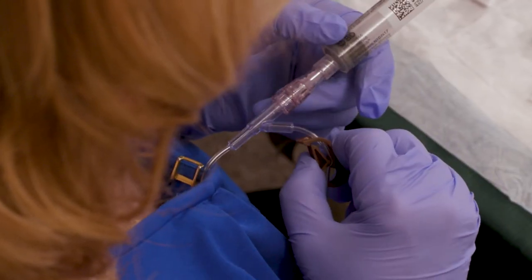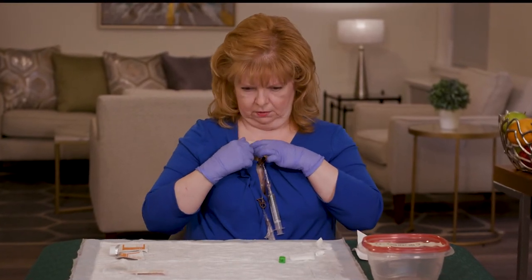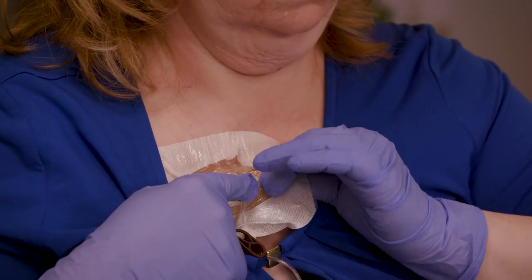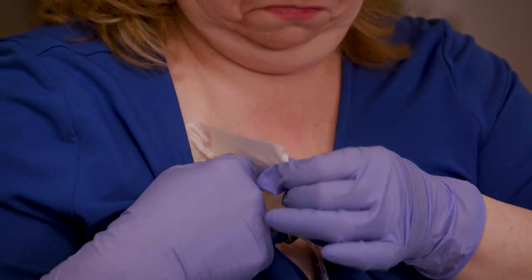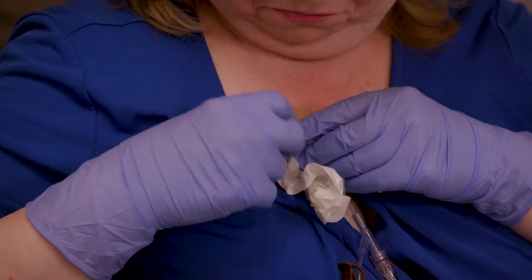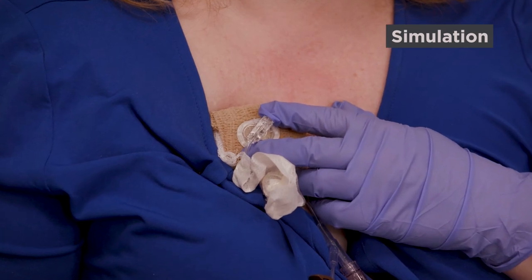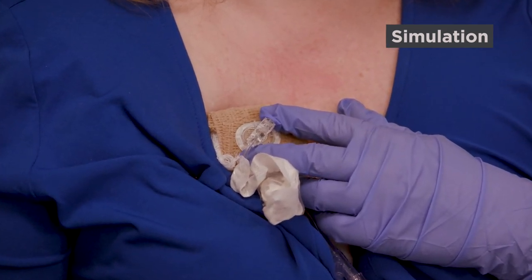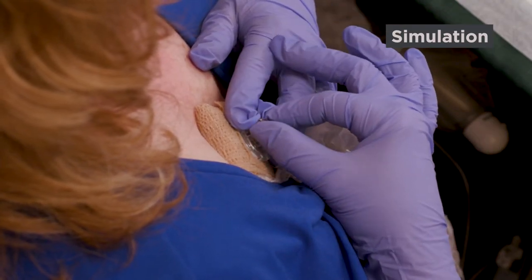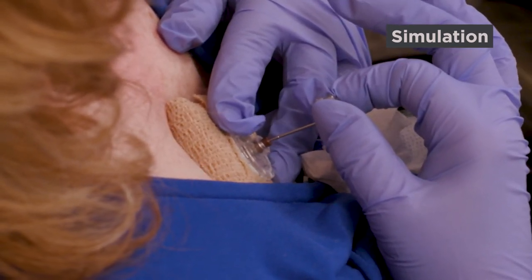Pinch the second clamp closed. Now that you've flushed your implanted port, you're ready to remove the needle. Carefully peel off the dressing over your port. Using two fingers of your non-dominant hand — the hand you don't write with — gently push the needle's safety-hinged base against your port. Use your other hand to firmly pull the textured handle up until you feel a firm stop and the needle locks into the safety position.